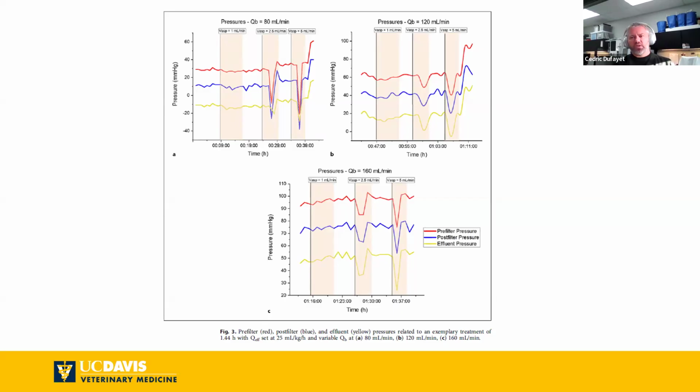how can you be sure that you're actually getting a sample that is coming out of the hemofilter and that you're not suctioning from your venous chamber, for example? Or are you actually sucking blood out of the dialyzer faster than it should, resulting in maybe not as much urea clearance as you should have had?